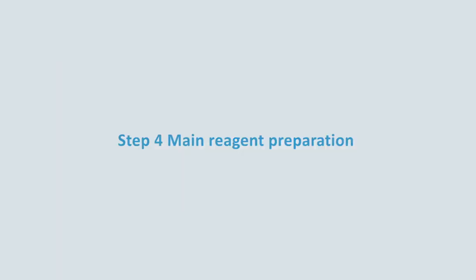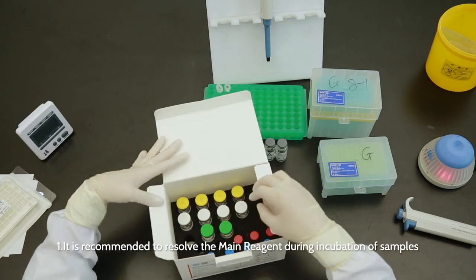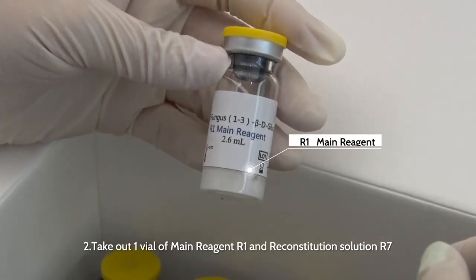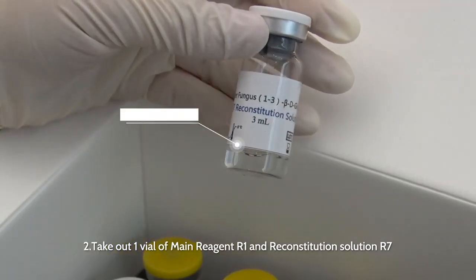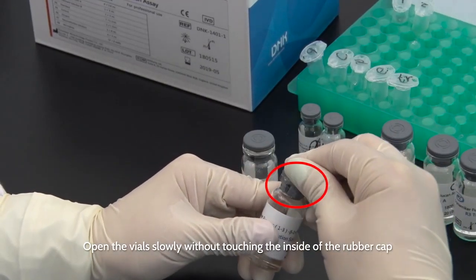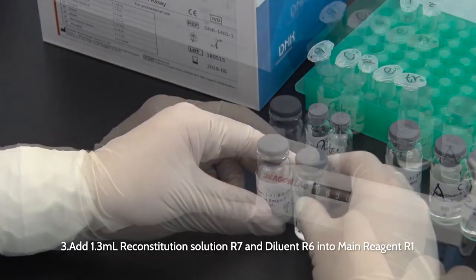Step 4. Main reagent preparation. 1. It is recommended to reconstitute the main reagent during the incubation of samples. 2. Take out 1 vial of main reagent R1 and reconstitution solution R7. Open the vials slowly without touching the inside of the rubber cap. 3.